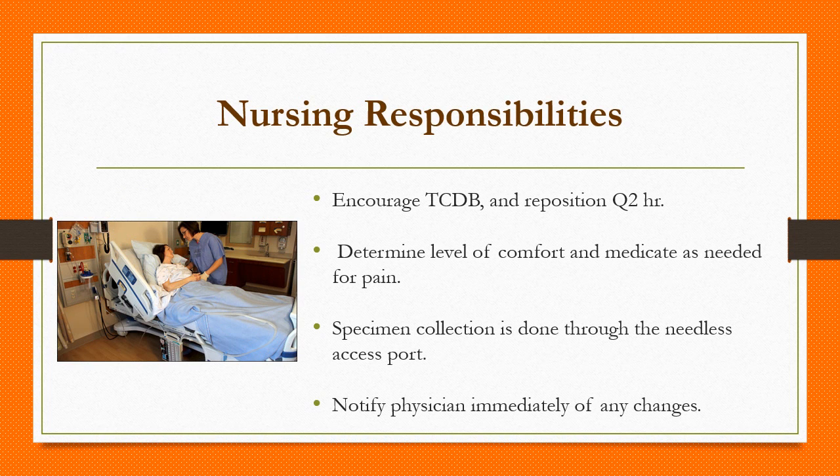Encourage your patient to turn, cough, deep breathe, and reposition every 2 hours. Continually monitor your patient's level of comfort and medicate for pain as needed. Should the physician request a specimen collection, this can be done through the needleless access port located on the corrugated inline connector. Notify your physician immediately for any changes in your patient's status.